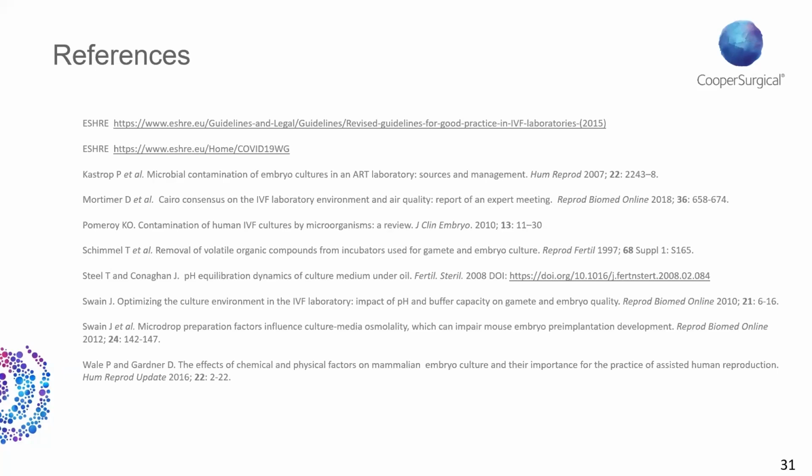Try to do them on a regular basis and just have the ones in there that you need, because although I mentioned earlier that it's better to do it in a laminar flow outside of the main embryology lab, most labs don't have that luxury, so they have to do it within the main lab, and you don't want to have lots of plasticware cluttering up your work surfaces and your flow hoods, and you don't want to produce lots of VOCs into the lab if you can help it.